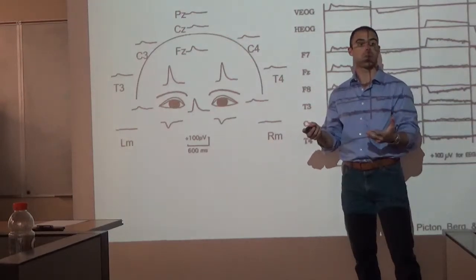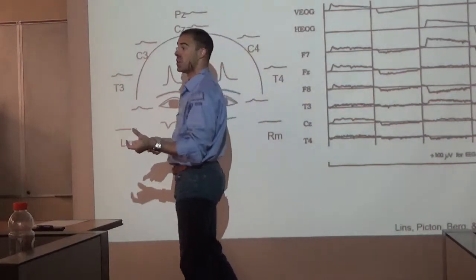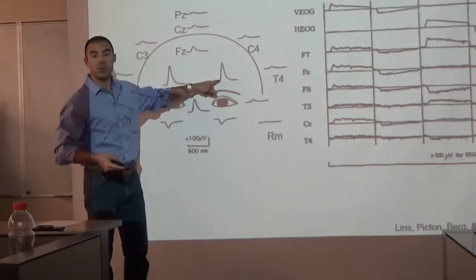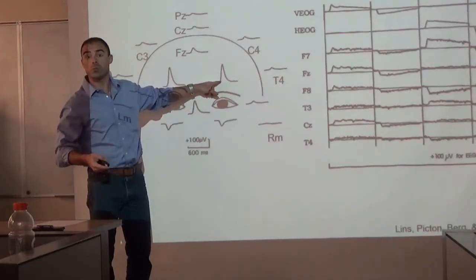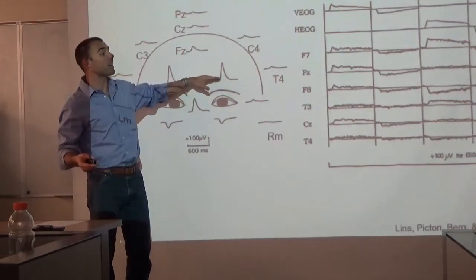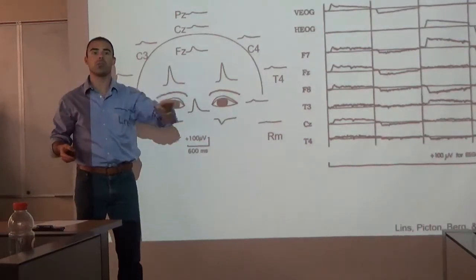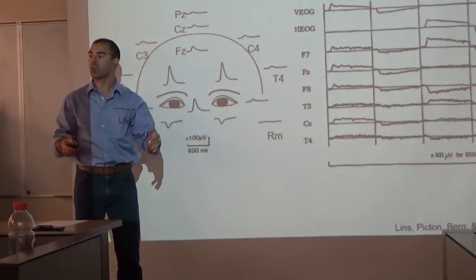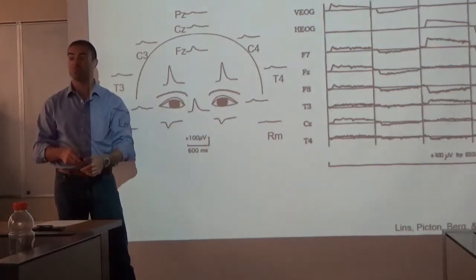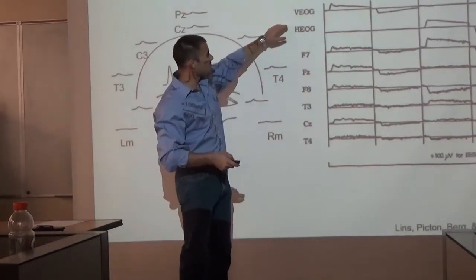So you can use that rate of decay to work backwards: if I know that an effect here is not brain activity but an artifact, you can subtract it from all the different sites at a proportional level based on that decay function. We'll talk about how we use that to correct for artifacts later in today's conversation.